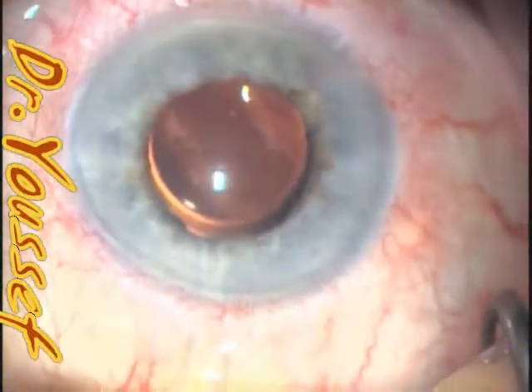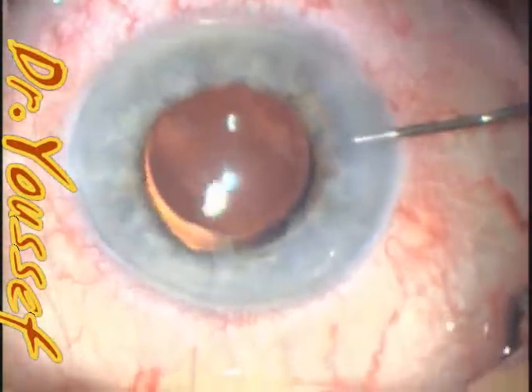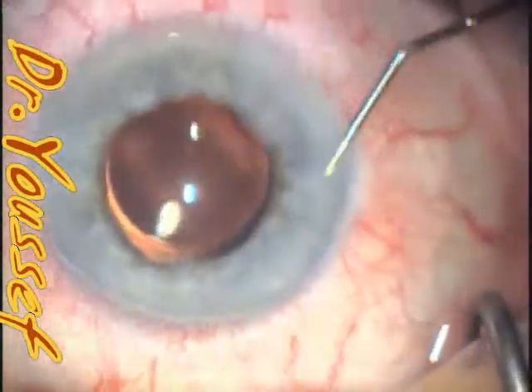There's no too much peaking of the pupil as we see sometimes with the hooks, because the Malyugan will produce an eight-point support. The wounds are hydrated. Thank you very much.